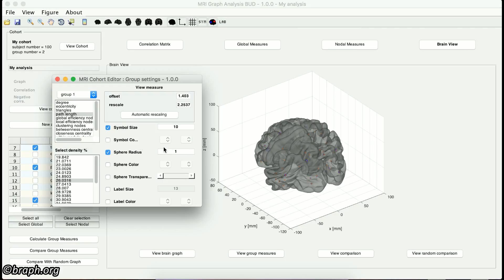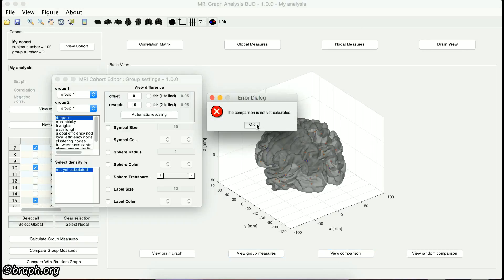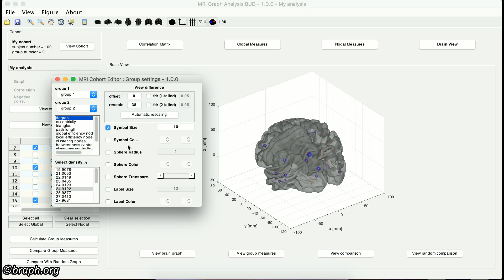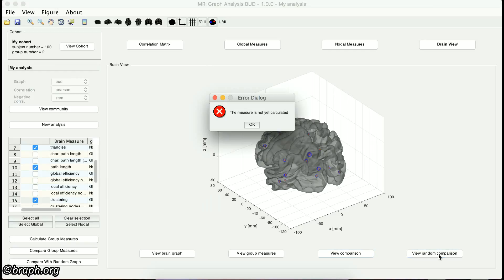To visualize the group measure comparisons, click on the View Comparison button. Here, after you have selected the groups, the measure, the density or threshold, and your visualization method, you can select the single-tailed or double-tailed false discovery rate checkboxes to only show the regions with significant p-value. You can define the limit for the p-value in these boxes. To view the results of the comparison with random graphs, you can click on the View Random Comparison button and use the same visualization method.